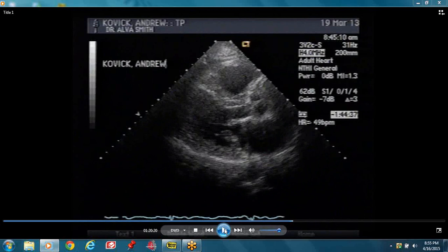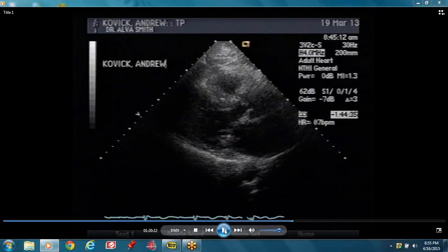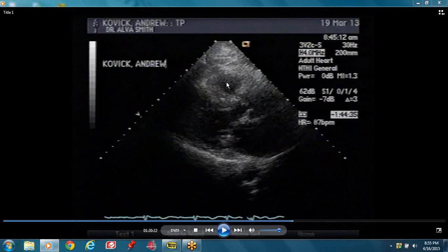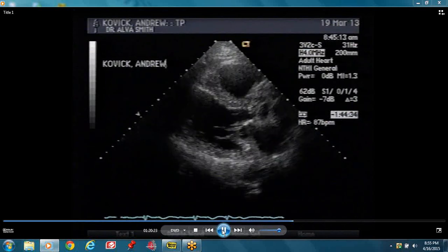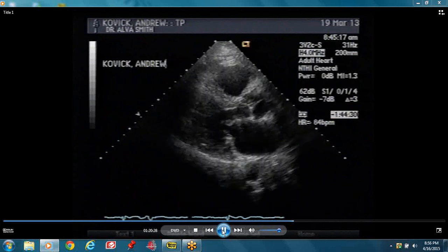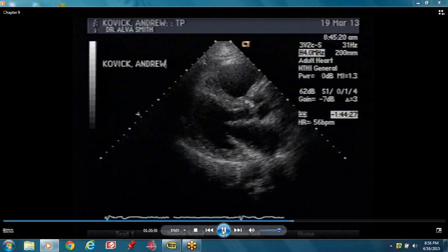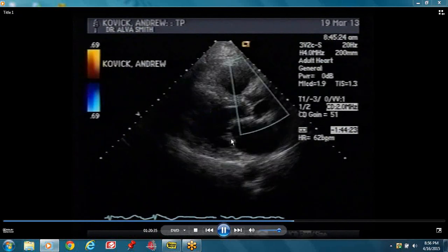Looking at this study, one of the obvious things is that the aortic valve is a bit thickened and it's not opening properly. There's also thickening of the mitral valve and it looks like there's calcification. Also look at the septum — the septum is a bit thick. The aortic valve is not opening properly, so this is a patient who has aortic stenosis. The mitral valve posterior leaflet looks a little bit restricted.